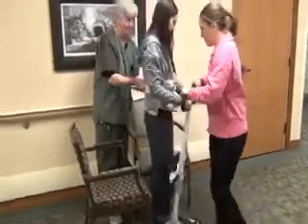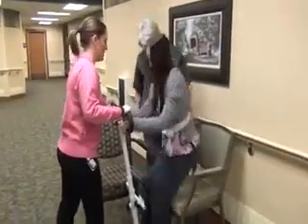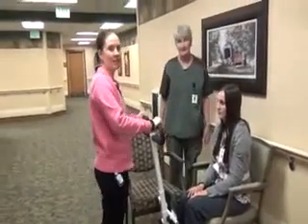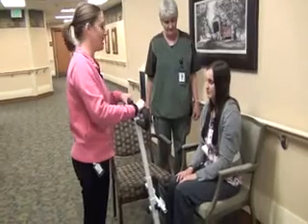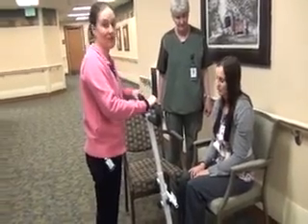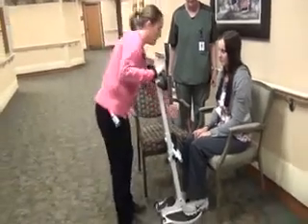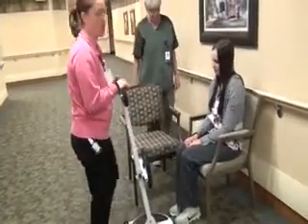You're going to slowly turn the disc until they're positioned to sit. At that point, apply the brake again and the patient can now sit back in the chair. The second person doing this transfer is going to be there for safety, ensuring that the patient doesn't lose their balance and helping them to stand up or sit down. When you're done with the transfer, you can assist the patient in lifting up their feet if they need help and sliding the disc out of the way.